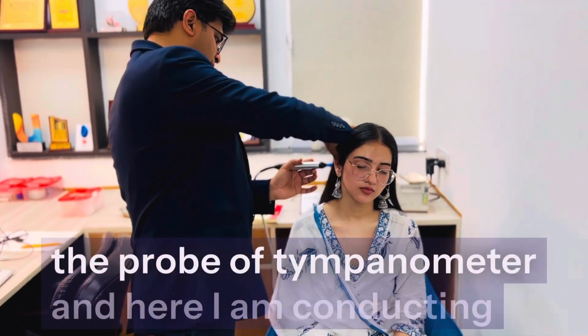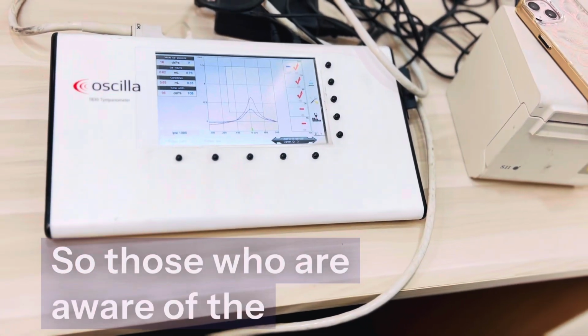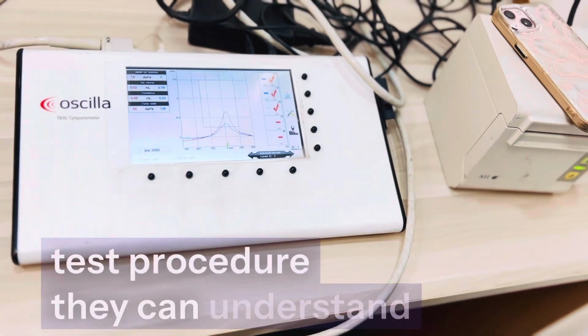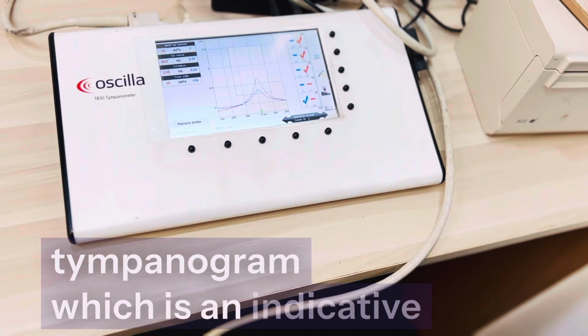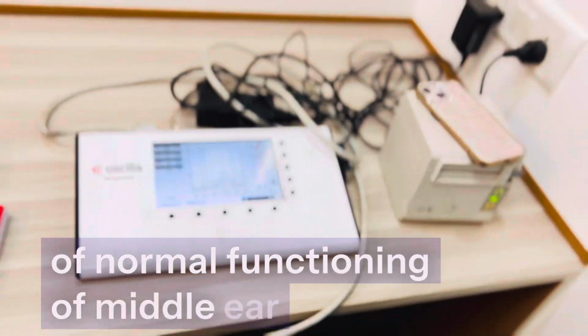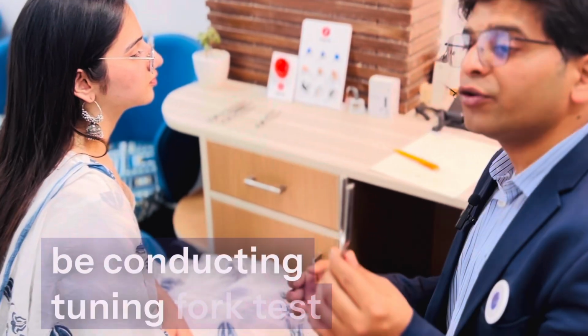So this is the probe of the tympanometer, and here I am conducting, and you can see, those who are aware, you can maybe show on the screen. So those who are aware of the test procedure, they can understand. This is a type A tympanogram, which is indicative of normal functioning of the middle ear. Thank you, Shagun. Now this is a tuning fork, and I will be conducting the tuning fork test.